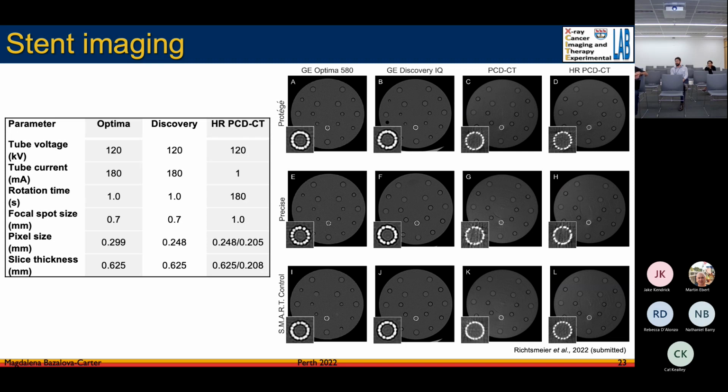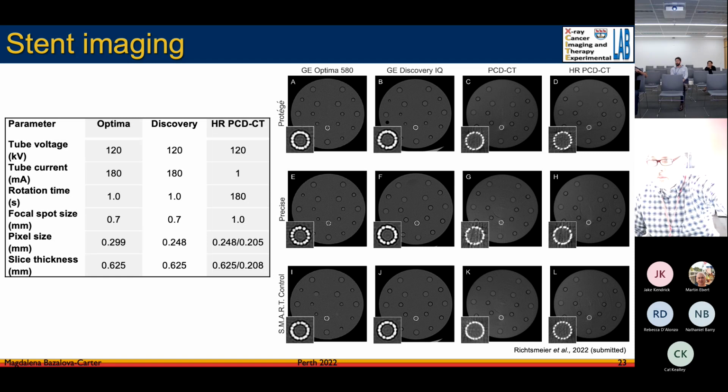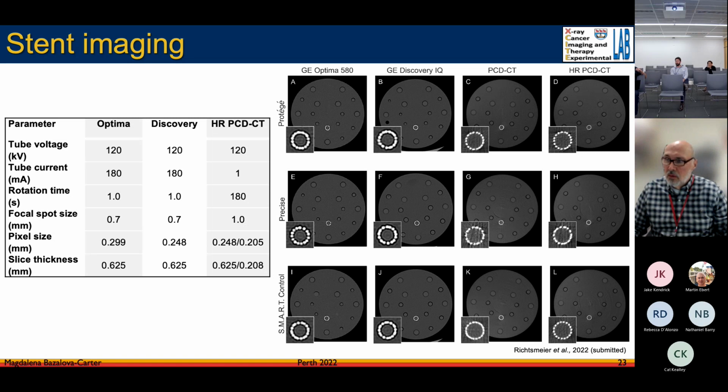Okay, well, thanks so much. And obviously, we're not one of the referees, because that's not what they brought up. The Optima certainly is an 80 centimeter scanner, and we used that because we had that in the clinic. It was really easy for us to access. The Discovery one, we were working with our radiologist, and he said this is the top scanner that we have around in Vancouver. So that's the reason why we used it. But I completely understand your concern, and we'll have to see if we can find a scanner that has a smaller bore and as a result provides higher spatial resolution.